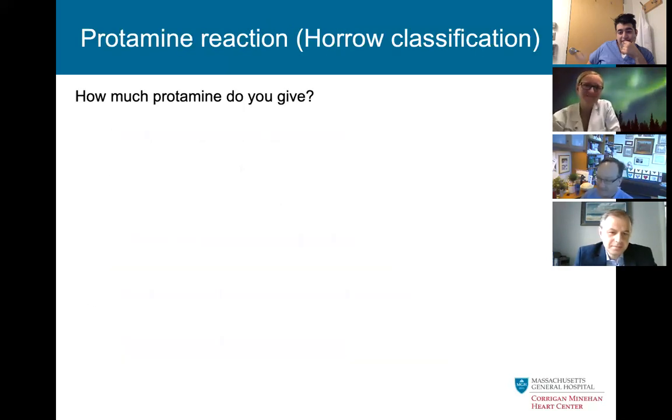Great. Yeah, I agree with Sergey. The only couple additional things to say is that rather than trying to remember exactly what the thing is, in the course of your training, you will come up with a system that works for you. There are some principles that I think most of us will adhere to. One is that filling the heart will displace the air from the heart.